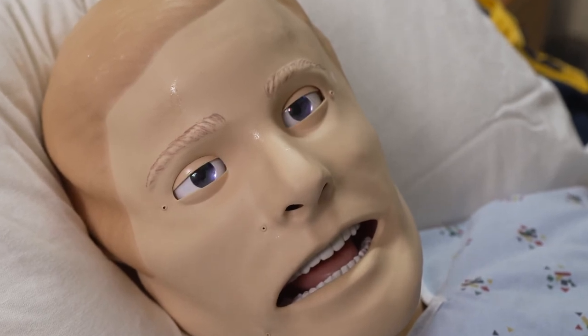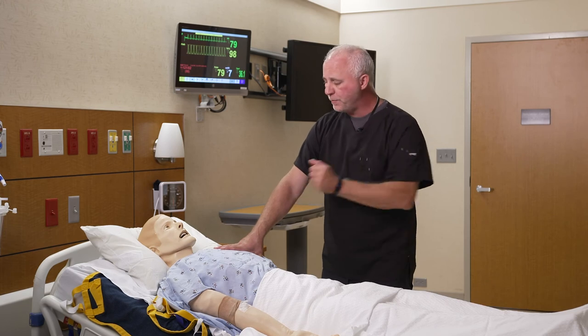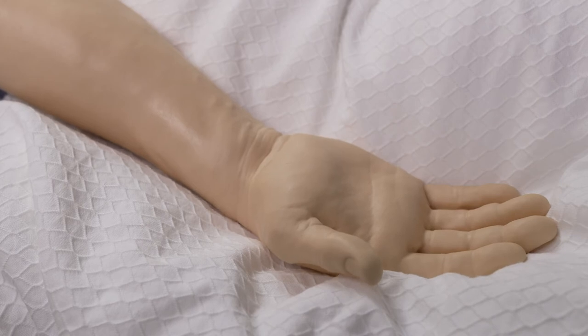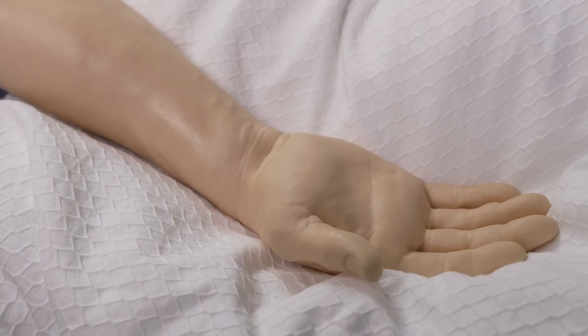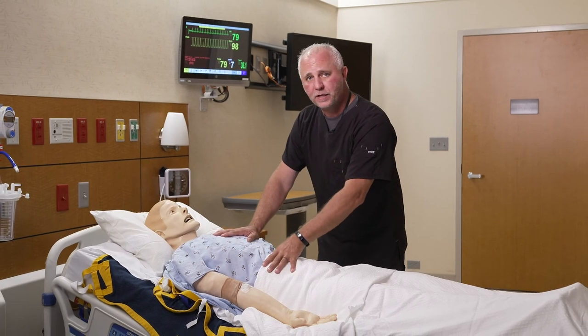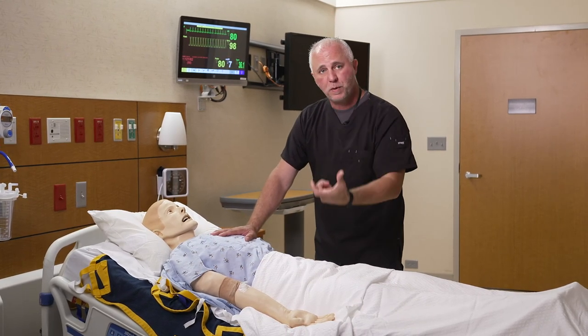Another thing the mannequin can do is simulate a seizure. We'll put the mannequin in a seizure — if you look closely, he's having a seizure. It can be a tonic or a tonic-clonic seizure. It's simply the mannequin vibrating and moving, but that sparks a response in the learner.